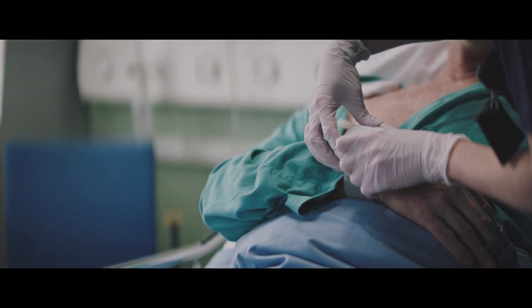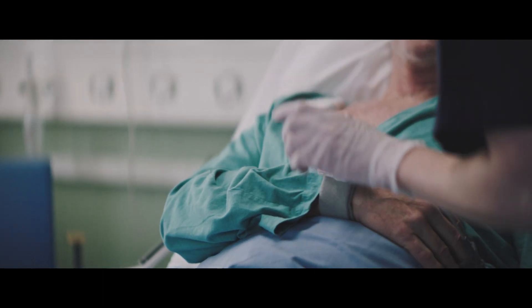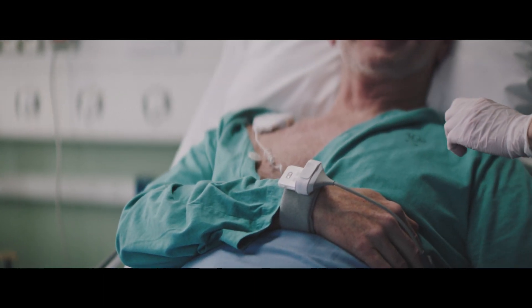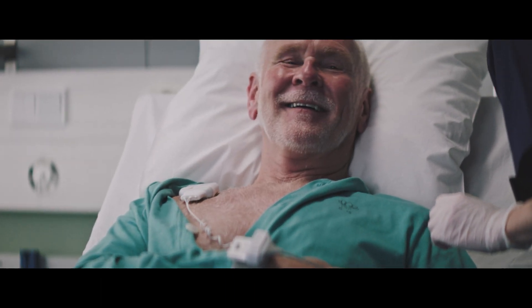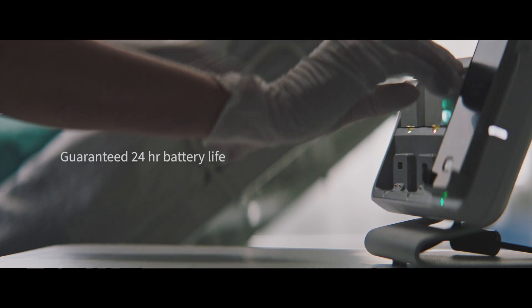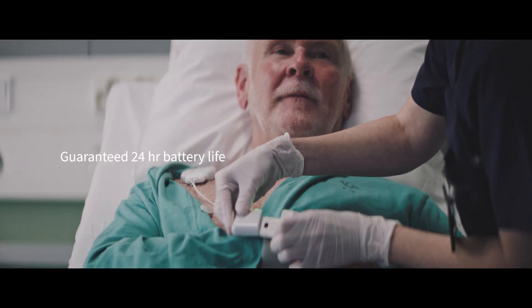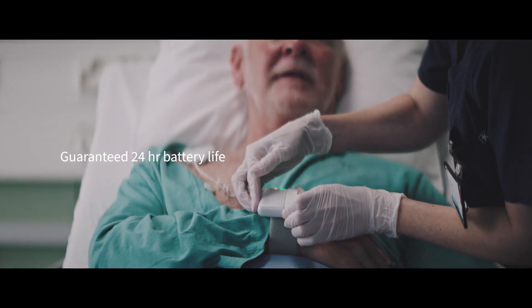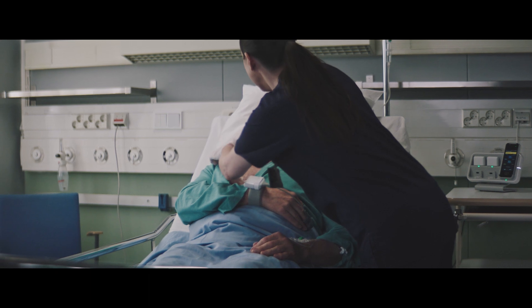Both the patient monitor and the sensor batteries can be charged at the bedside charger. The sensor batteries are designed to be swapped once a day to ensure continuity of monitoring and to support easy battery management.